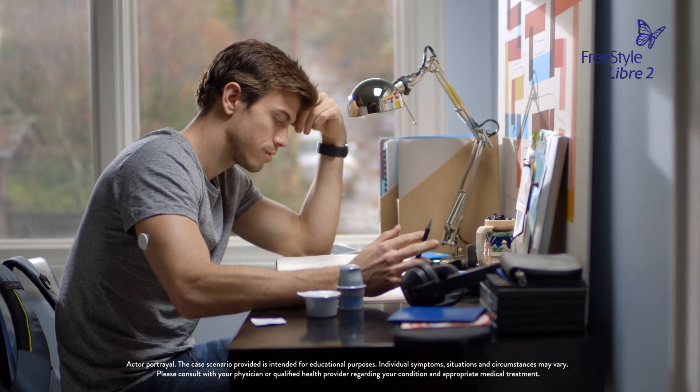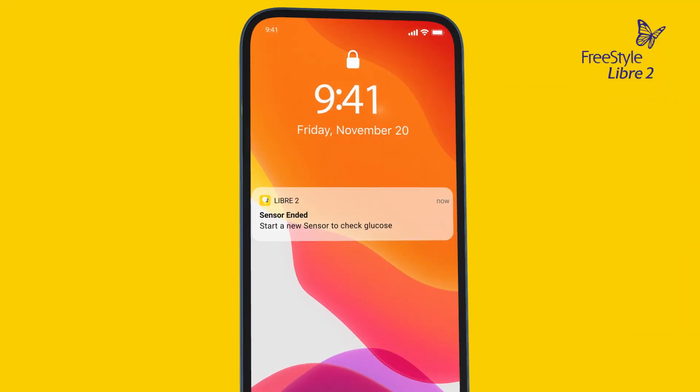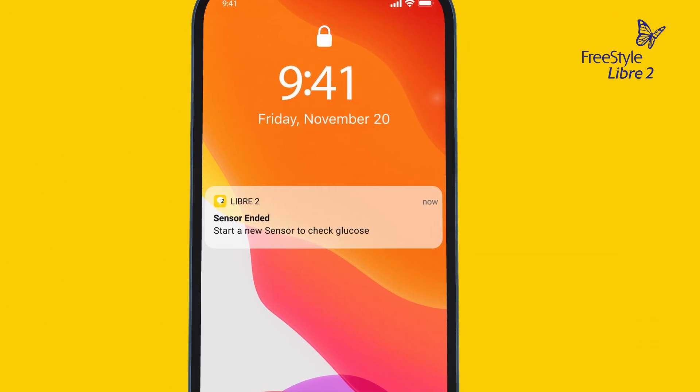When your sensor reaches the end of its wear period, it will automatically stop. At this point, the app or reader will let you know it's time to replace the sensor.